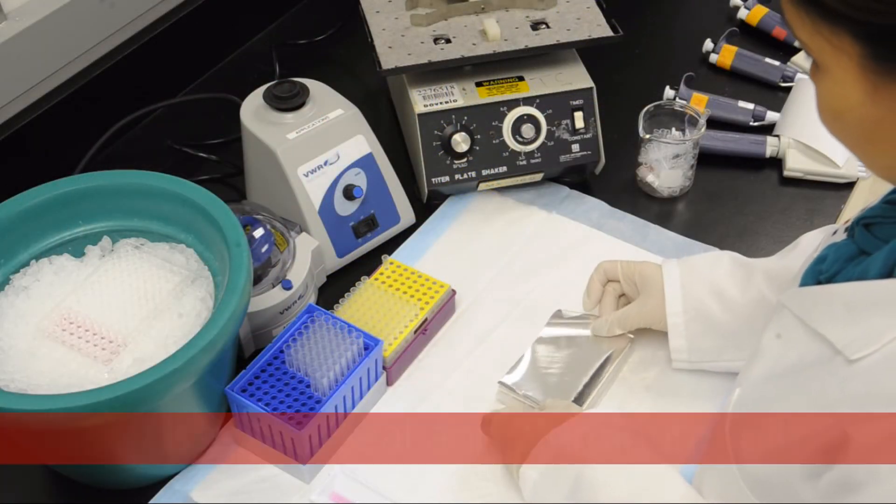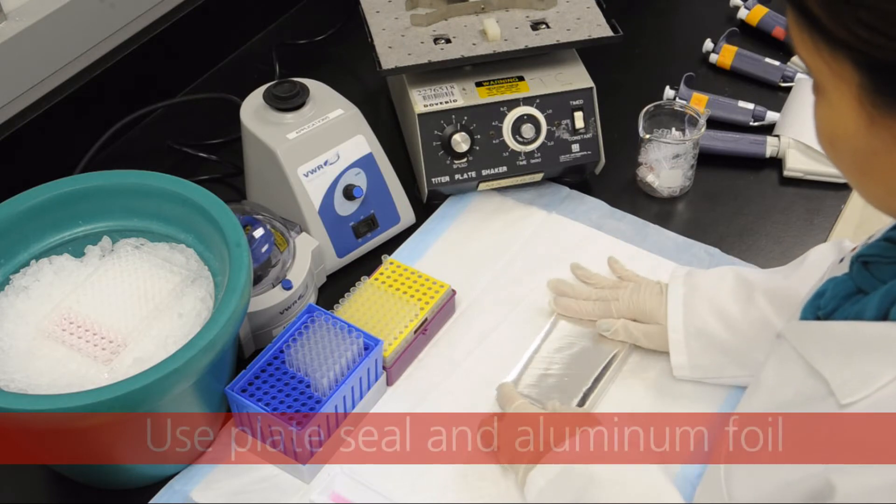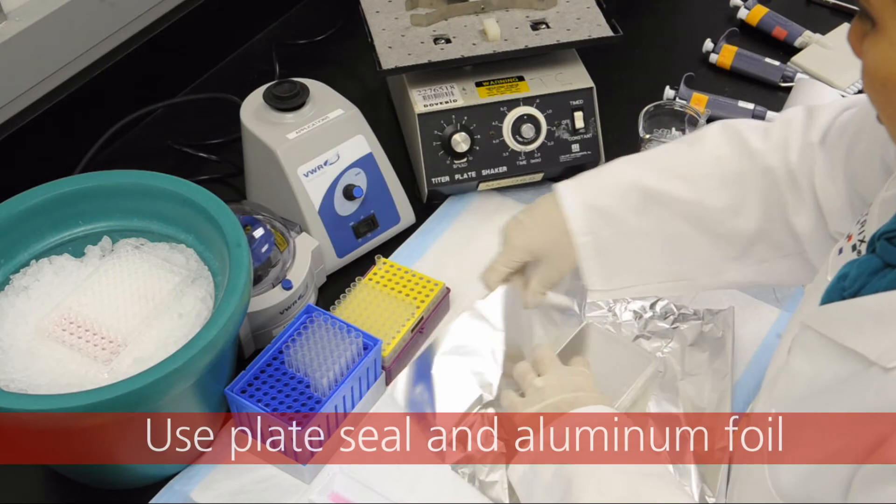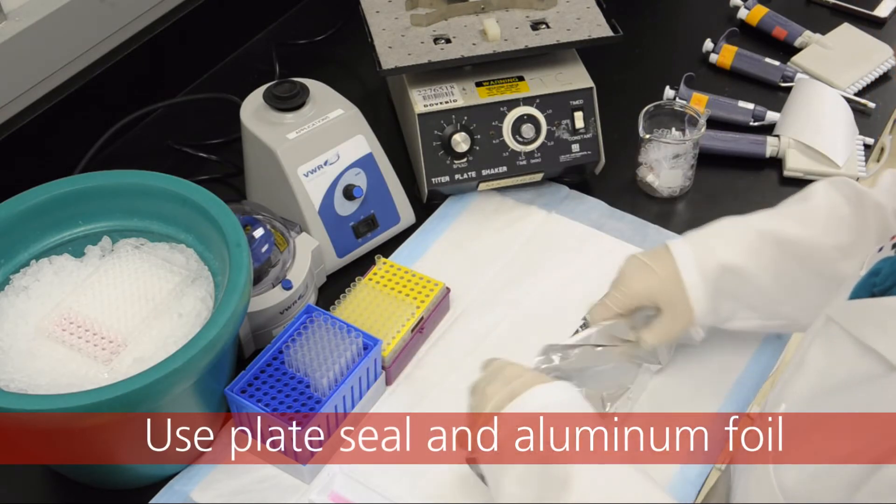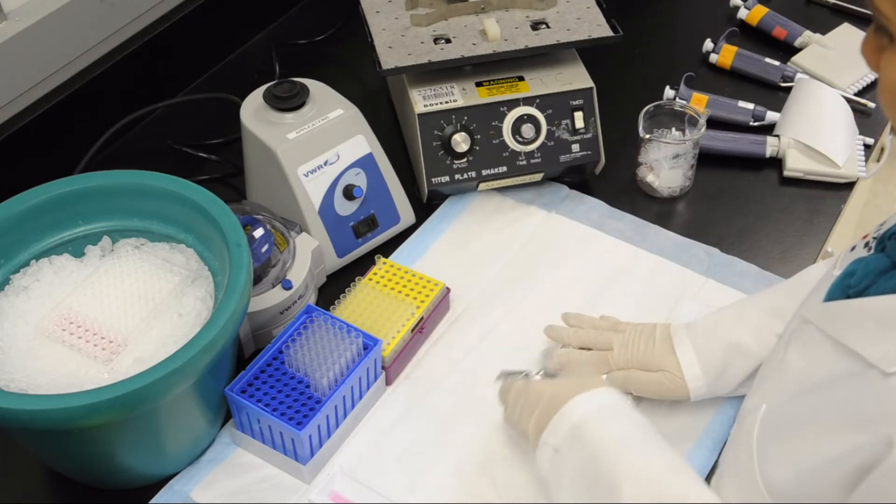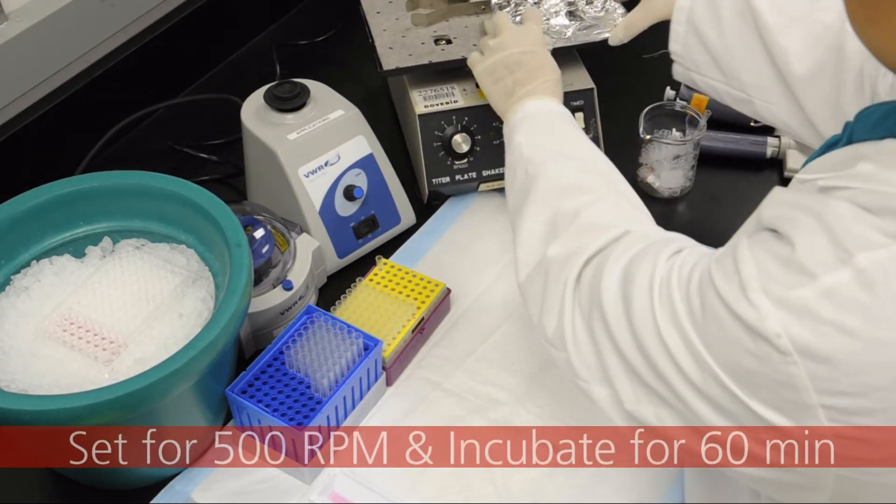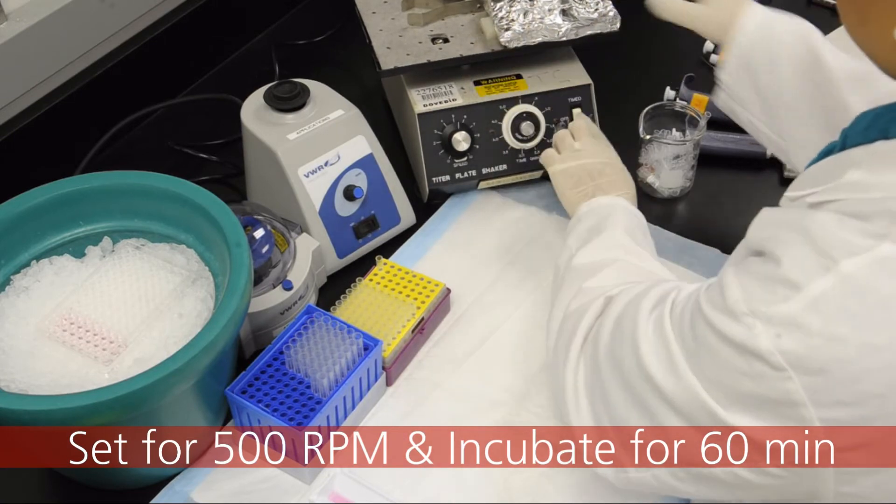Once the samples and standards are loaded, seal the plate with a plate seal. Because the beads are sensitive to light, wrap the plate in aluminum foil. Place the plate on the microtiter plate shaker, set for 500 RPM, and incubate for 60 minutes.